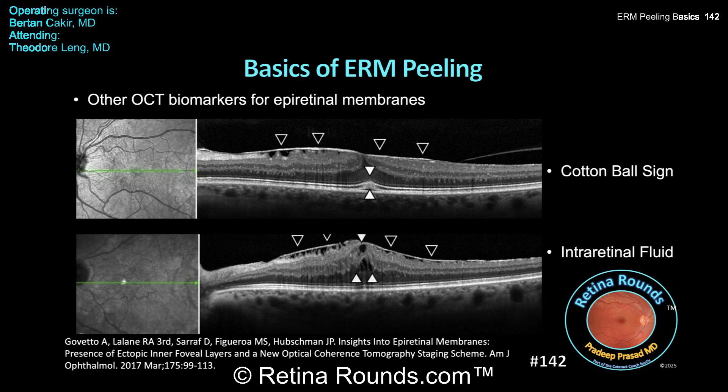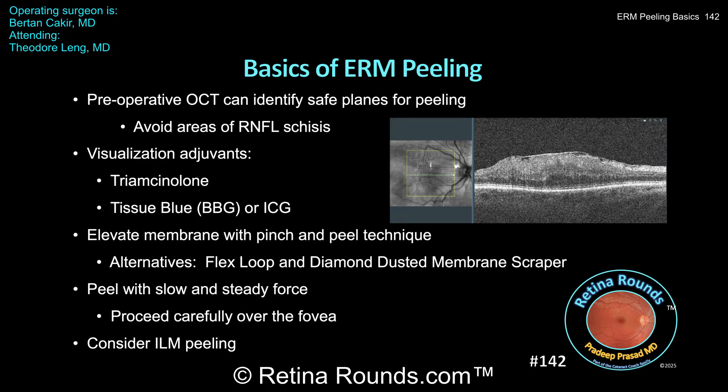Other biomarkers to look out for include the cotton ball sign — a hyperreflective focus in the outer retina at the fovea, shown in the upper image — as well as intraretinal fluid, shown in the bottom image. Both can be associated with worse visual symptoms and may serve as markers to help decide whether to intervene. The OCT can also be helpful for surgical planning: elevations in the ERM on OCT can help the surgeon identify a safe spot to initiate peeling, and areas of RNFL schisis should generally be avoided since initiating a peel there can further exacerbate damage to the nerve fiber layer.